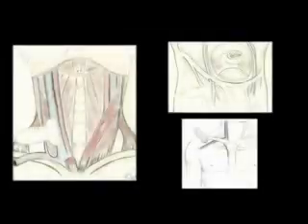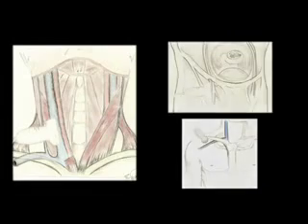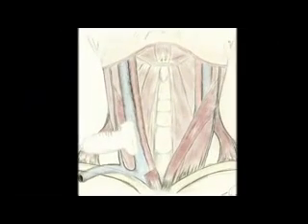There are several locations in which central veins can be cannulated with dynamic ultrasound guidance. The internal jugular vein is often the best choice for ultrasound-guided central line placement. The internal jugular vein can be cannulated in the usual position between the heads of the sternocleidomastoid muscle. It may also be cannulated at any other location where there is minimal soft tissue between the skin and the vessel.